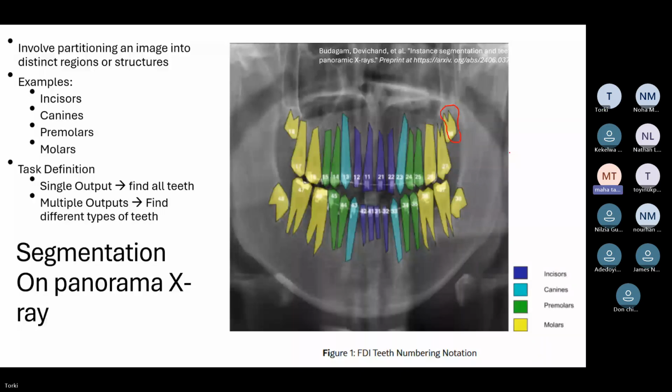Okay. The mask is the color you gave it. Yes. I draw a boundary now on the predicted mask for tooth number 28, and I'm not looking at any other thing now. I'm just looking at 28, right? Okay. So if the overlap is great, then you think that this segmentation is good. So let me tell you where the overlap is. The overlap is these colored red ones, right? Yes, so this is the overlap.